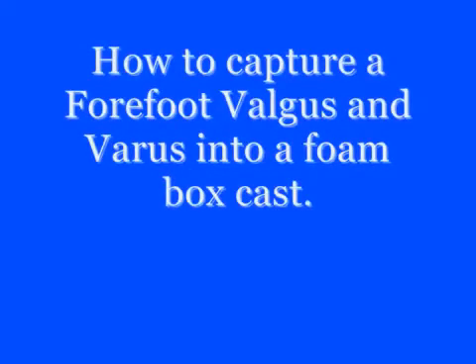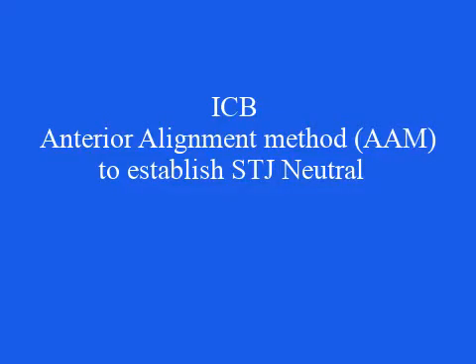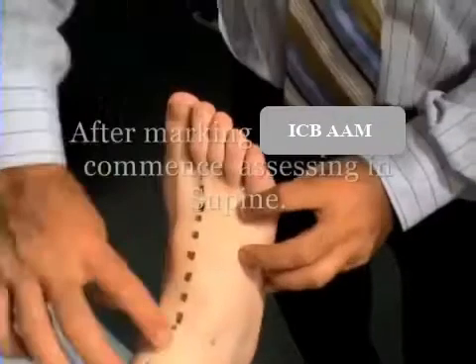How to capture a forefoot valgus and varus into a foam box cast. We'll be using the ICB AAM method for assessment and positioning in the foam box cast.